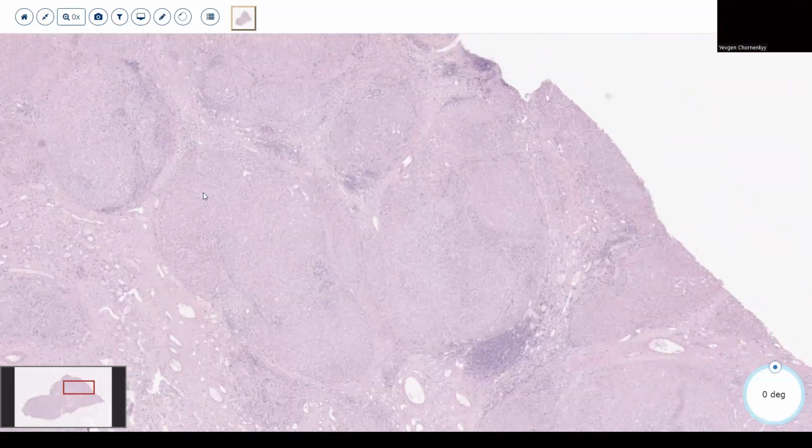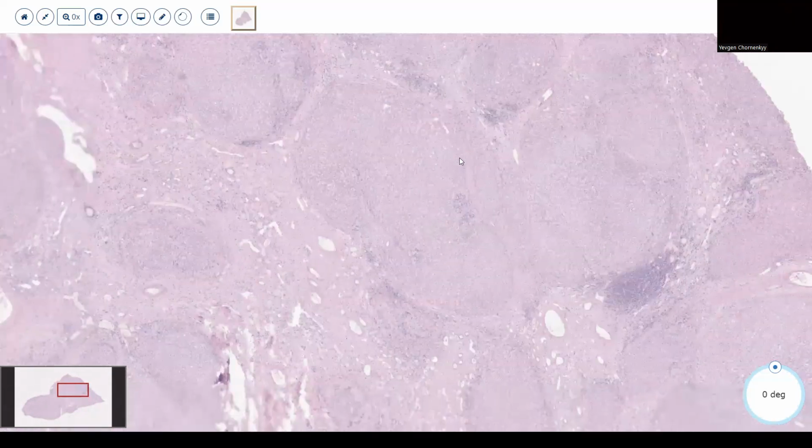But just looking at this, you need me to look at that? Really? That'd be nice. Let me have a question. What do you get for the pathology before you do the imaging?